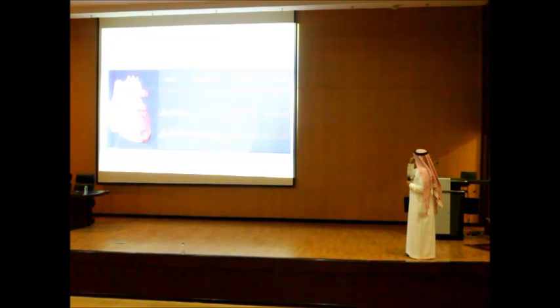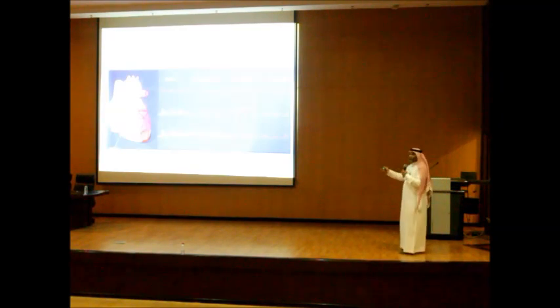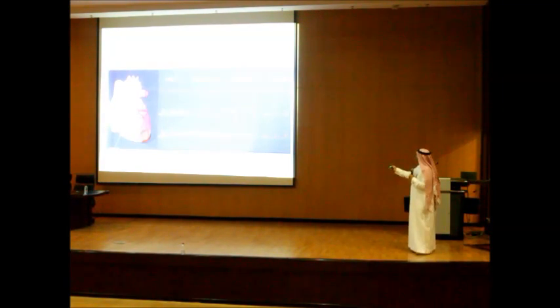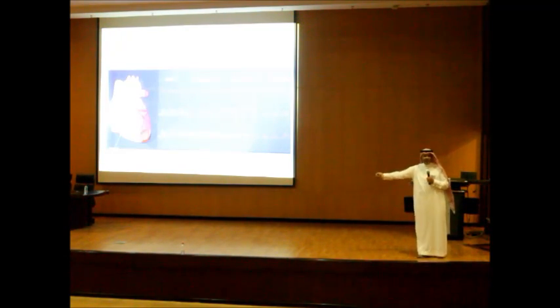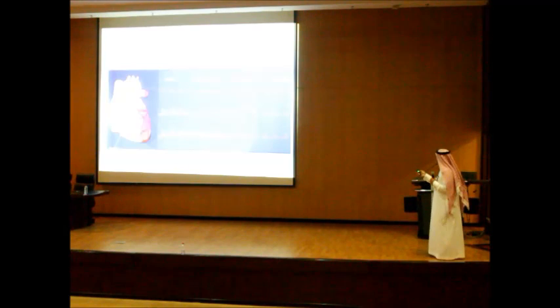What is this? Here, explain it. So you have this ST segment elevation here, in 2, 3, right? What else? When you read these things, you have to know the rate, the rhythm, the axis, the complexes, the differential diagnosis, the spot diagnosis. This is a clear infarction. When you have some infarction, what happens to the area opposite to it? Reciprocal changes. You see reciprocal changes?